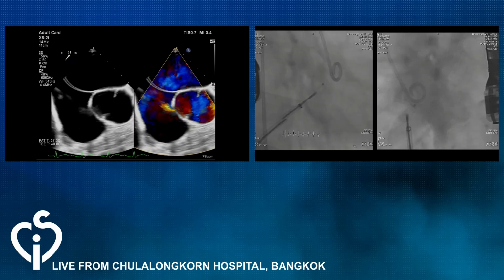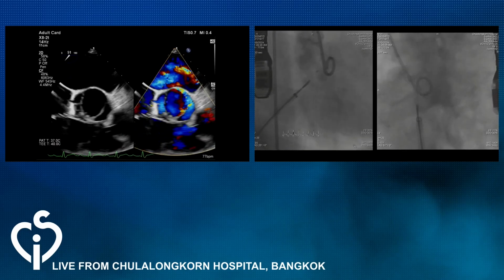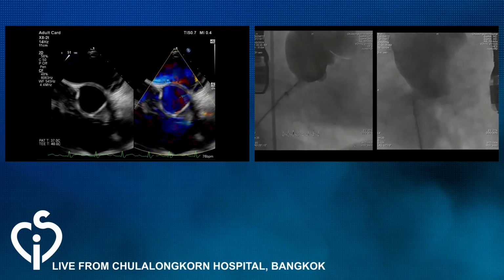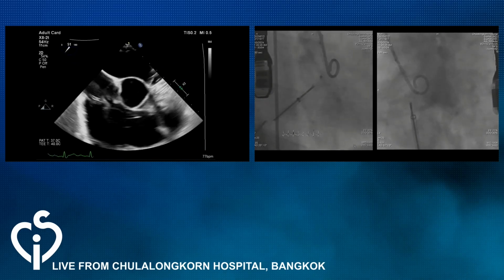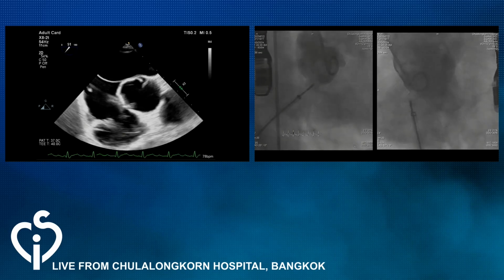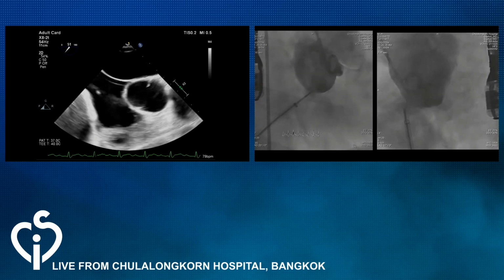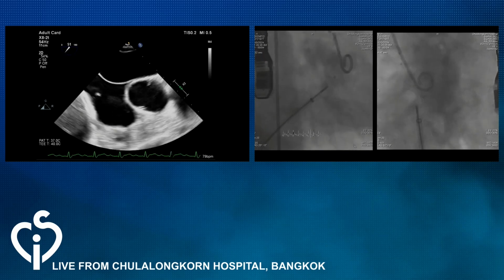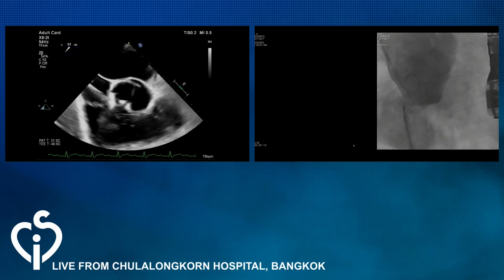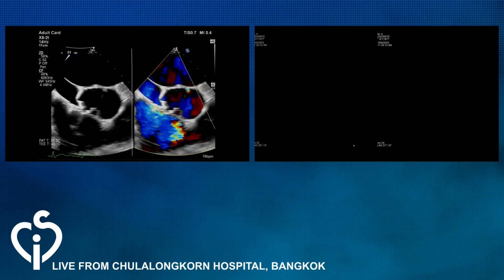Just a couple of comments. Incidentally, the aortic valve looks bicommissural in this particular patient, an incidental finding. In this case, because the device is still on the cable, it will adjust itself once you release it. I would wait maybe 10 to 15 minutes on the cable, see a repeat angiogram, and if there is reduction in the flow, I would consider this as foaming and probably release the device. I'm quite happy with the position, unless there is some additional leak which we cannot see angiographically.